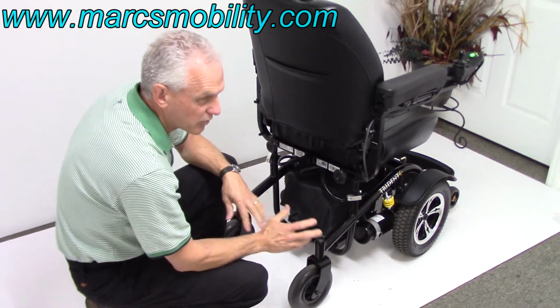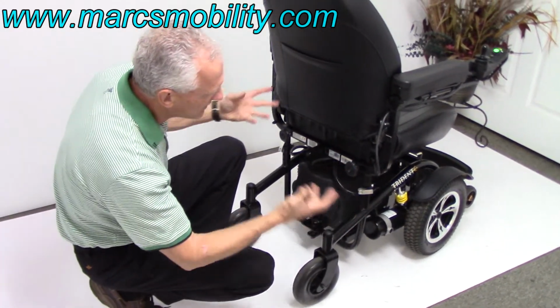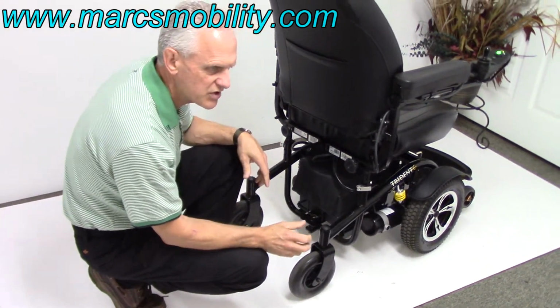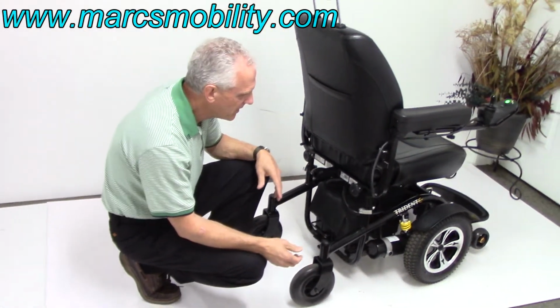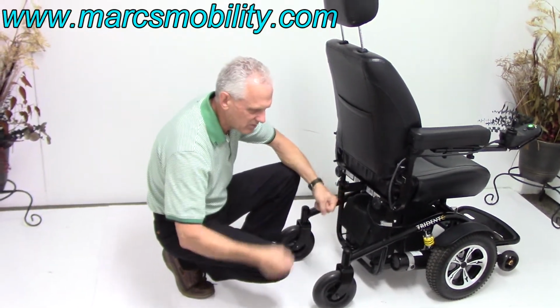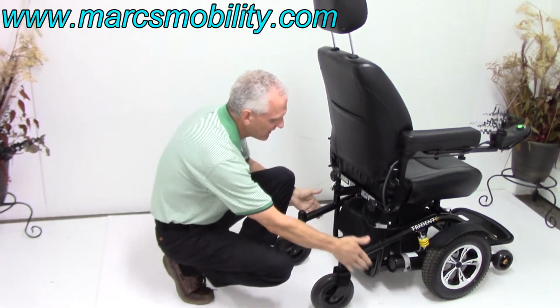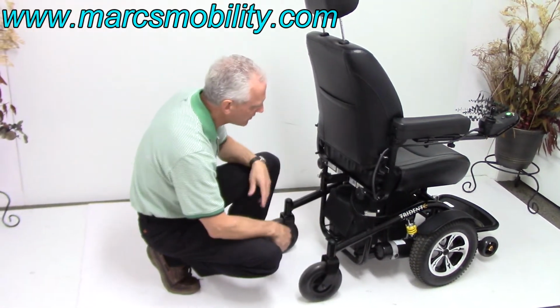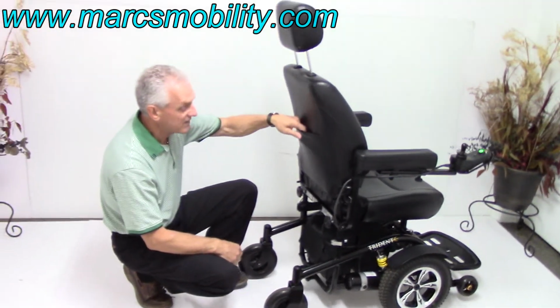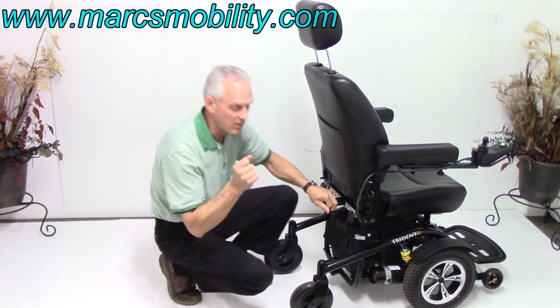So if you're traveling and you want to take the battery casing out and you want to lift a seat off, you could take this chair in 3 pieces. It's really not a portable wheelchair, but if you have help, the seat probably weighs 35 pounds. The 2 battery boxes are probably going to be 25 pounds each. So if you take the batteries out, you take the seat off, the only thing you have left is the frame with the wheels and the 2 motors, and that's going to be probably 50, 60 pounds. So it does come apart, but I wouldn't say it's a portable chair, but it does come apart.